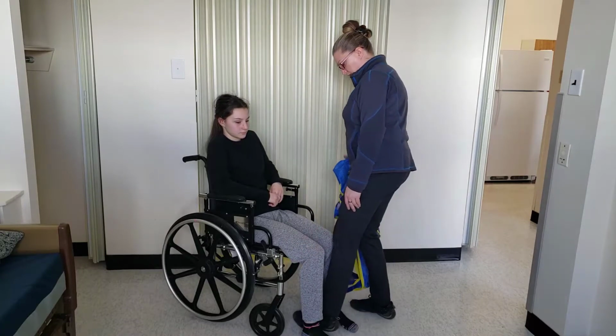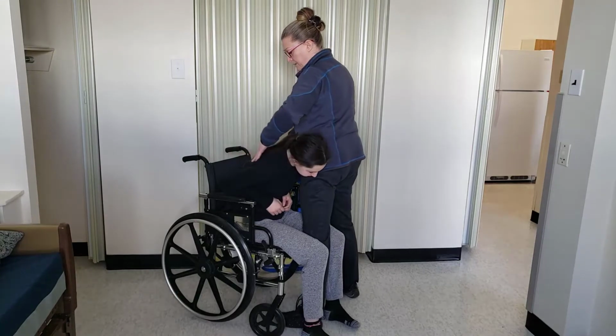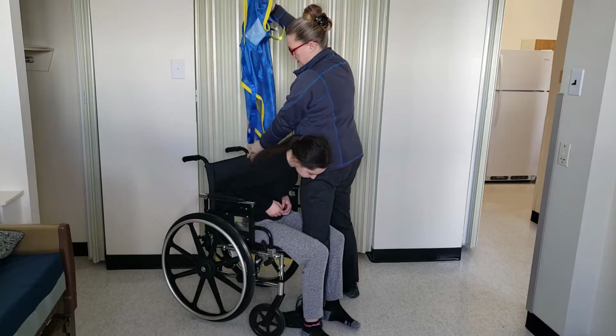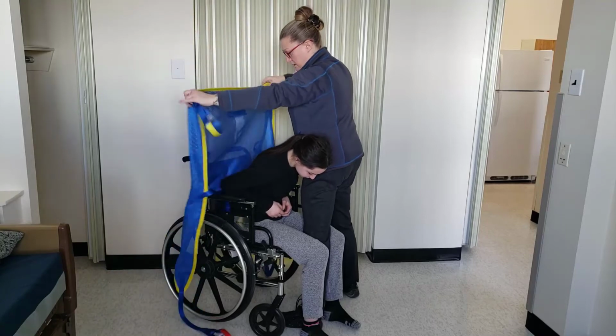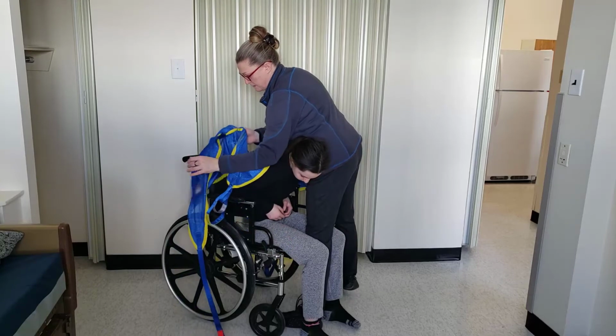If you put one foot in between theirs, you lean the tenant into your hip, then you can easily get access to the back of them. You want to make sure that the leg straps are on each side of the tenant. You want to make sure that the straps are going to be on the outside.